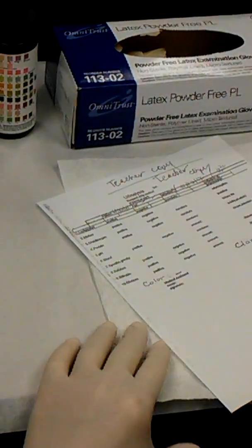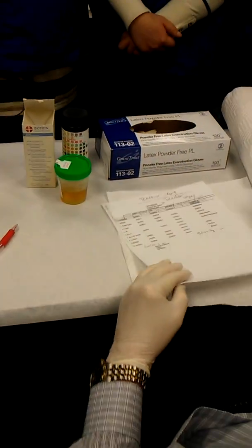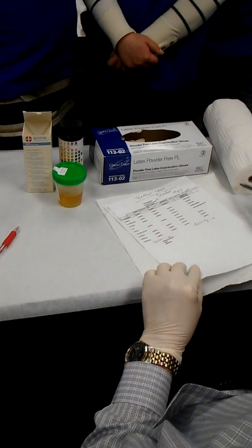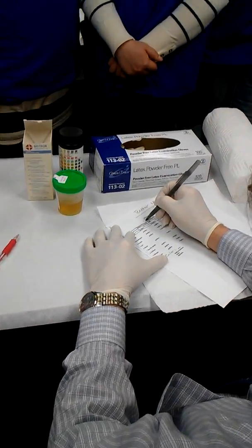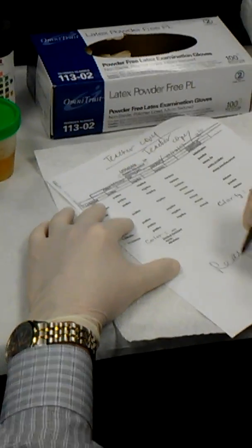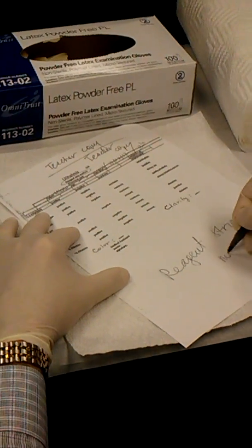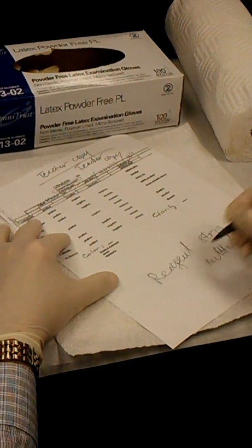Okay. So now we're using a method to detect substances in the urine. How do we call this method? It's written here: reagent strip method. So it's reagent strip method, right? So it's a screening test.